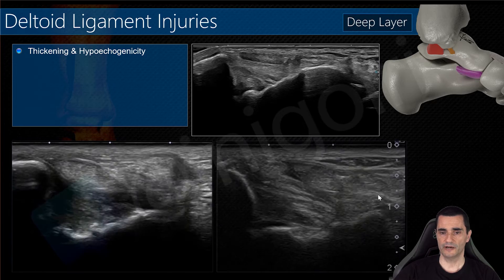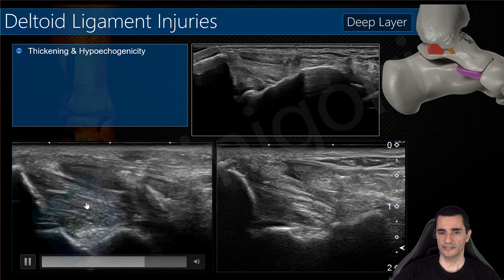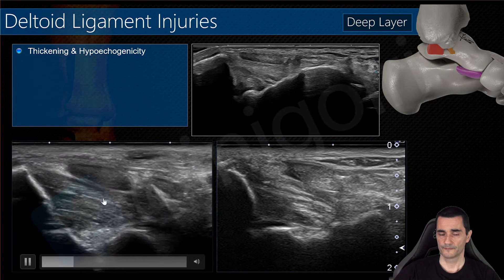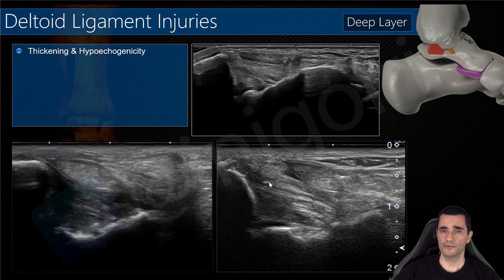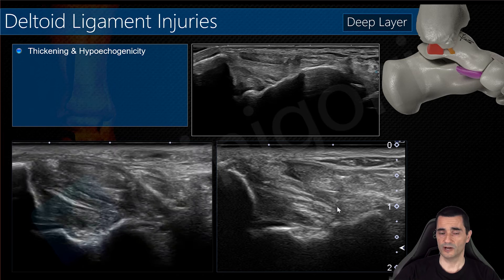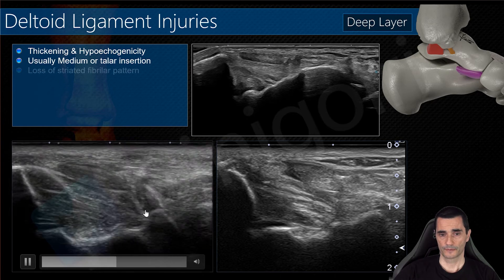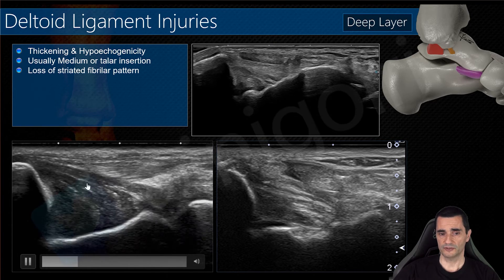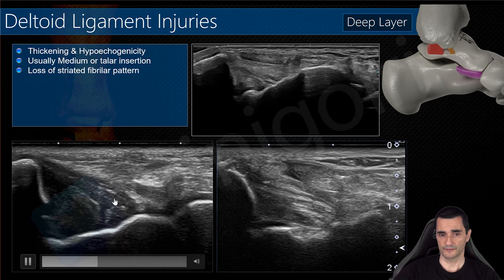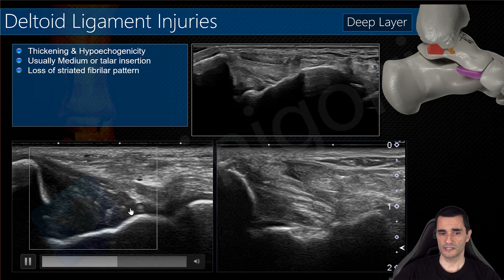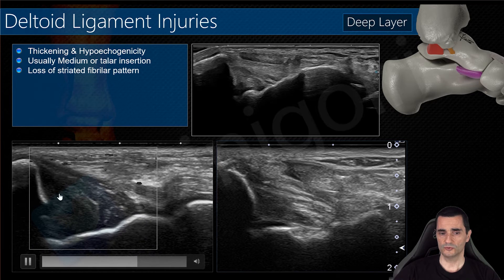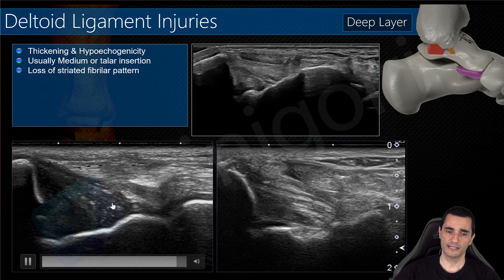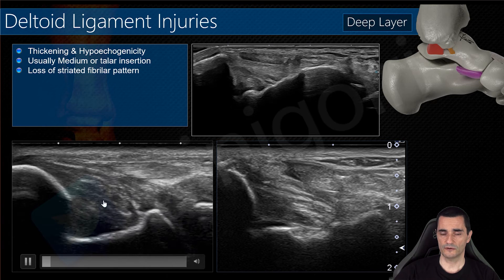Comparing with the normal side, you can notice the thickening and the hypoechoic ligament. When you are beginning with ultrasound, always compare with the contralateral side if you have doubts. This is another example showing thickening and loss of the fibrillar pattern of the posterior tibiotelar ligament. We can also use Doppler to assess vascularization, which can help us in mild injuries.